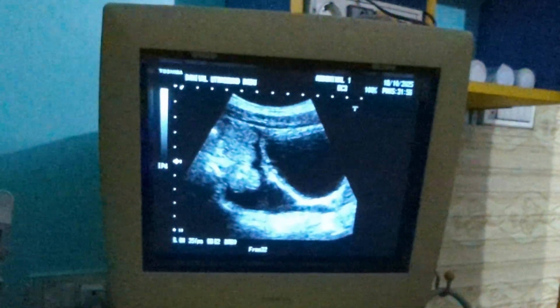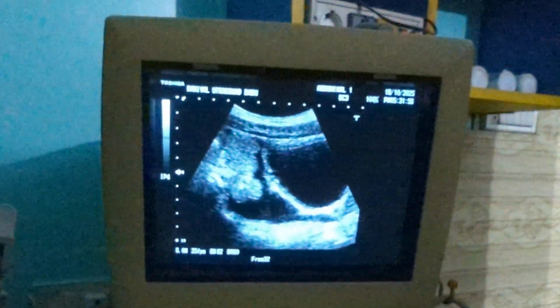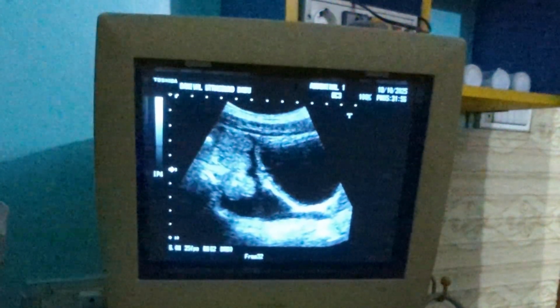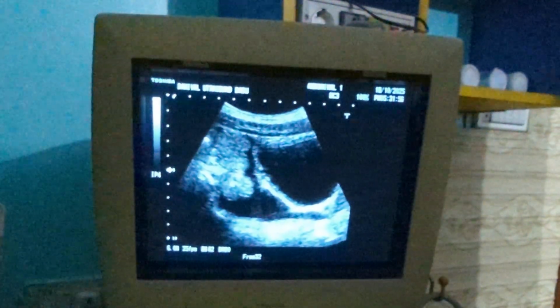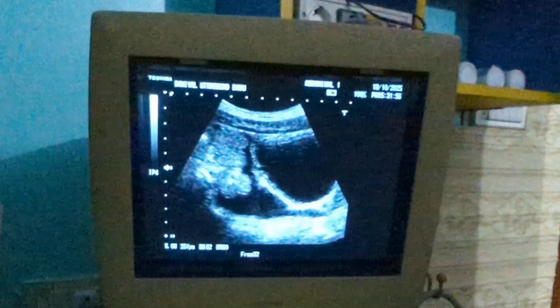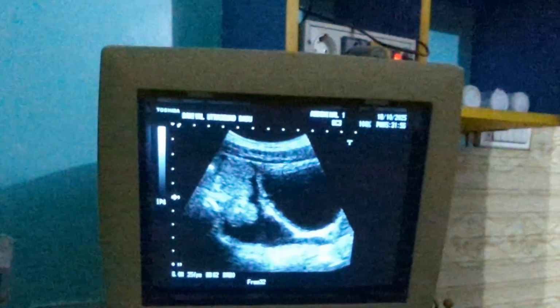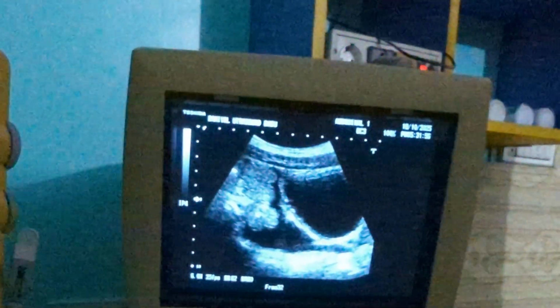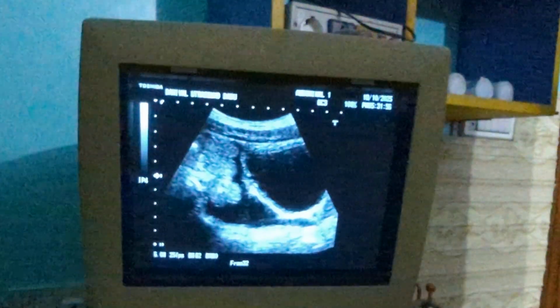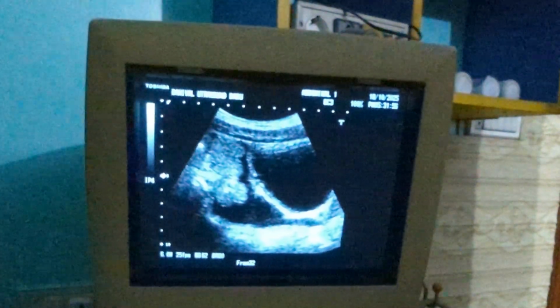Regarding the consistency of the peritoneal fluid, it is very important to understand. First of all, the echogenicity of the fluid gives important clues to its nature. If the fluid is a transudate, it would be shown as a completely anechoic black area, and even if you move the patient passively, it doesn't show any kind of echoes. So it is called anechoic fluid.